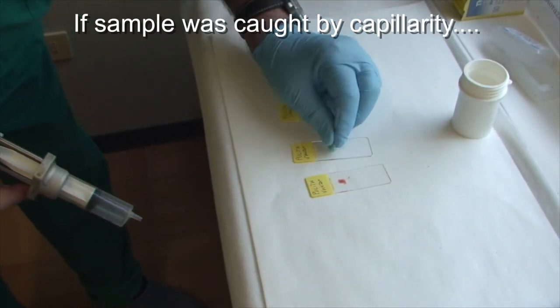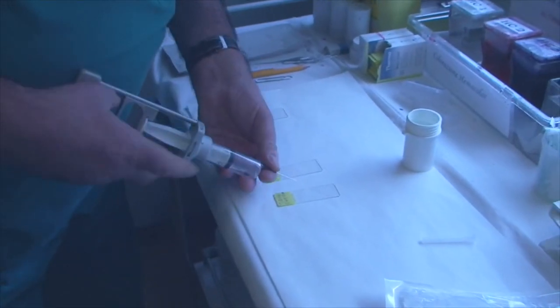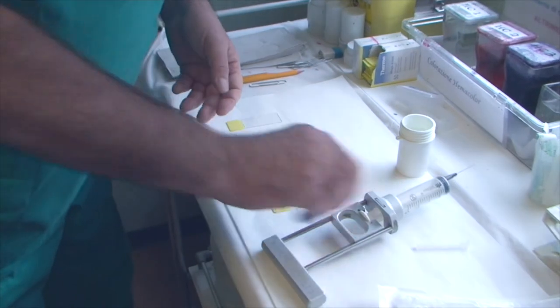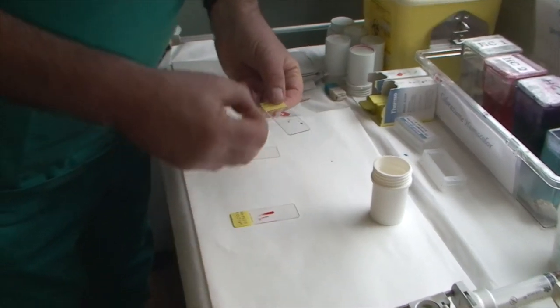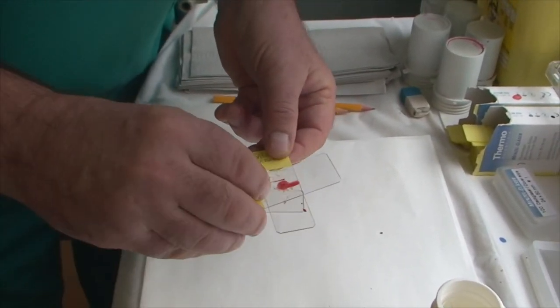If the sampling was carried out by capillarity, the only maneuver is to aspirate five to ten milliliters of air into a new syringe, engage the needle, and splash the specimen within the needle by fast pushing the plunger. If the amount of sample on one slide is too much, it may be spread partly over another slide.